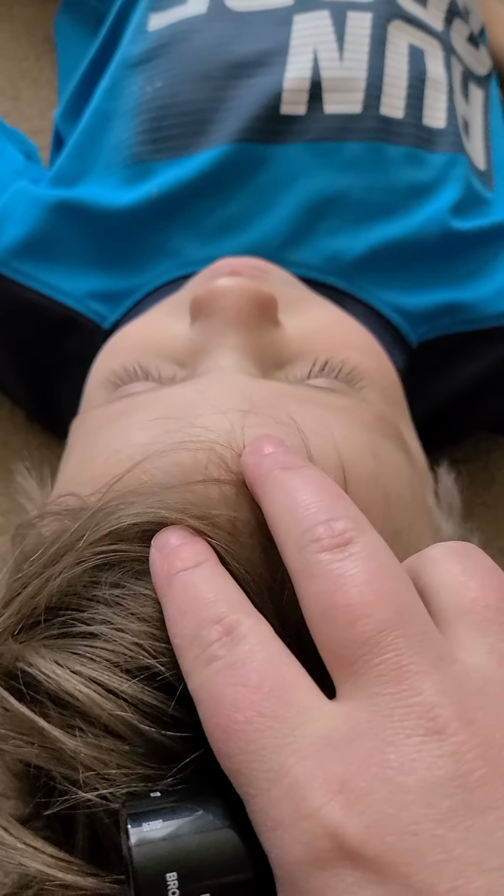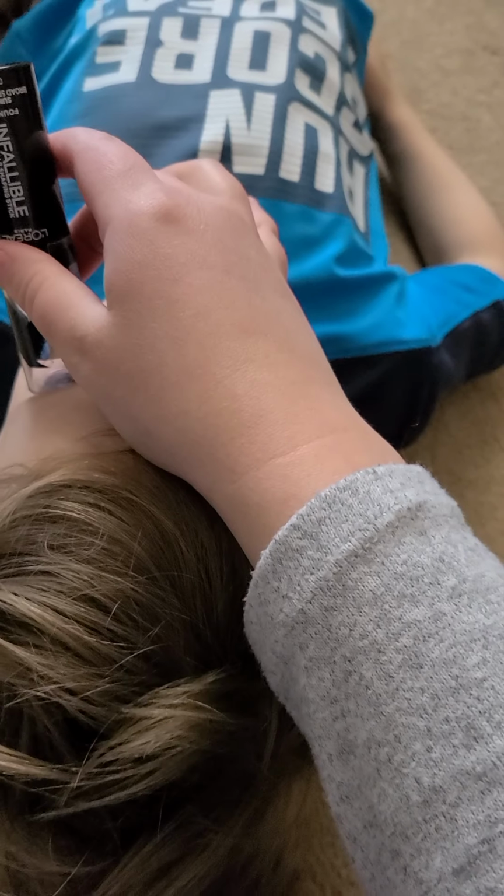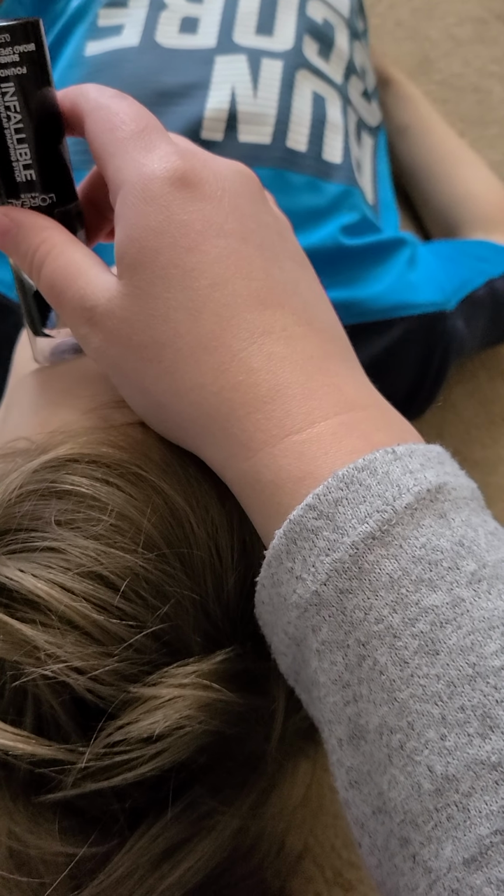We're going to have them close their eyes, and then the transducer is going to go just in the center of the eyelid while the eye is closed. This is the transorbital window. We can see the ophthalmic and the carotid siphon in this window.